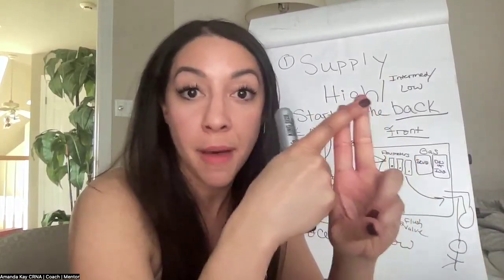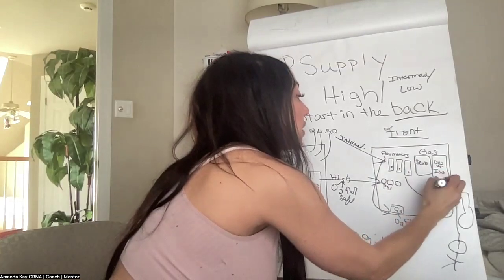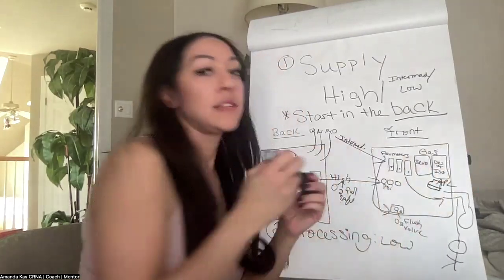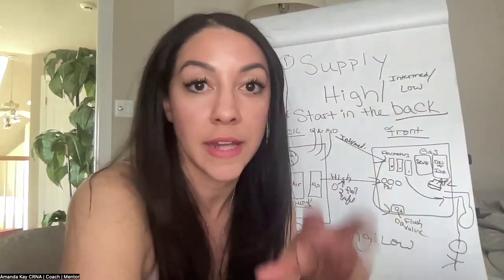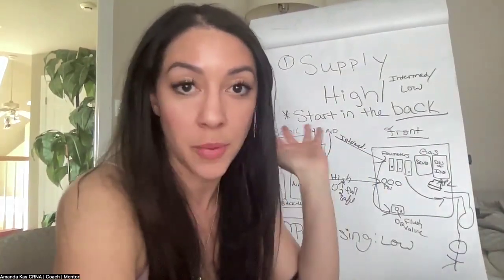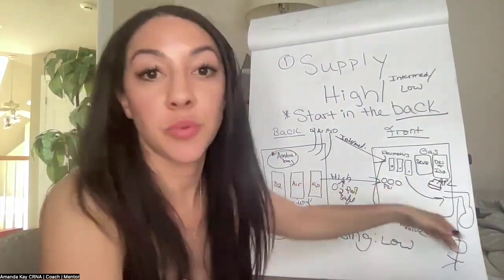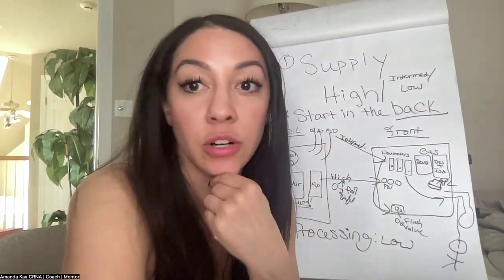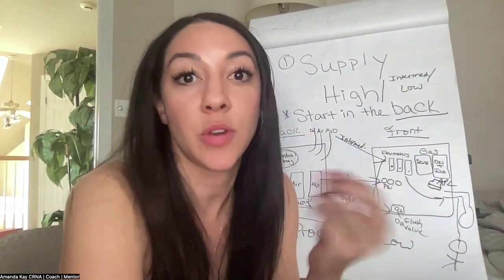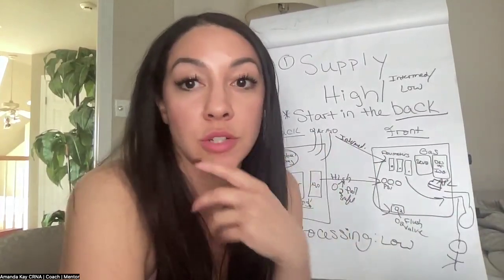Your APL pop-off valve is usually kind of over here. It's only used during spontaneous ventilation. When you turn the vent on, that is no longer part of the equation. But it basically allows you to adjust the pressure in the patient circuit. This is how you would do the Valsalva maneuver for surgeons if they want to check for any bleeding, increasing that intrathoracic pressure.